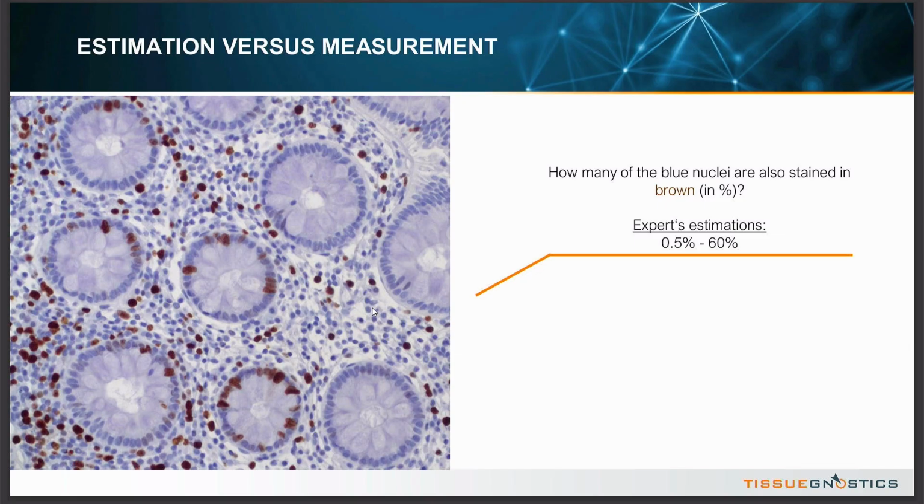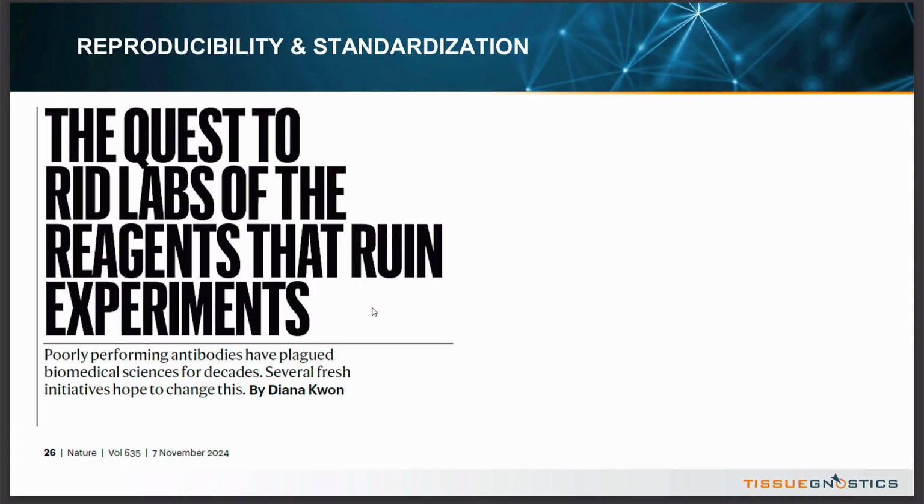And I think this is a significant difference, and it shows the main problem associated with visual evaluation. It not only depends on whom you ask, but also when you ask. If it's in the morning, or if someone is tired, if you sit in a dark room like microscopists often do, or if the sun is shining through the window, all this might change your judgment. And at TissueGnostics, we are offering software to introduce observer independence in the analysis of these slides, and also academically I'm working, I will show this in the next slide, on algorithms for next generation histopathology.